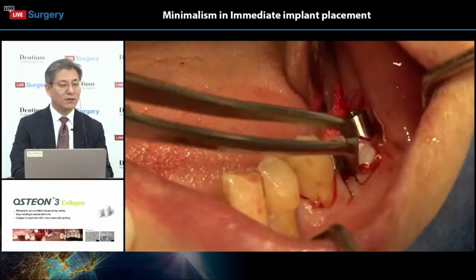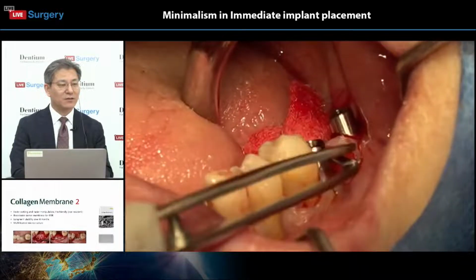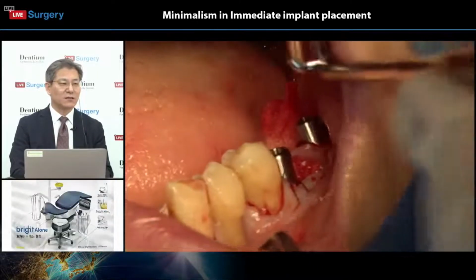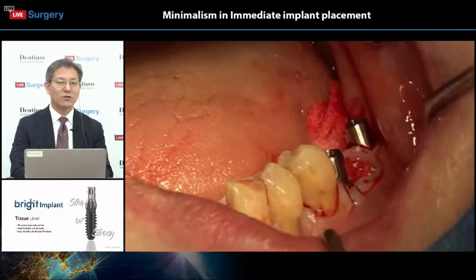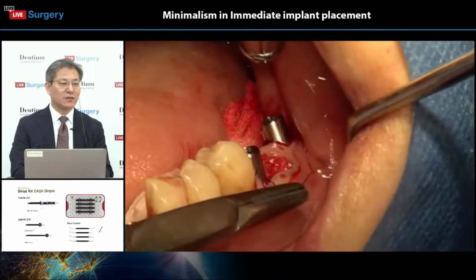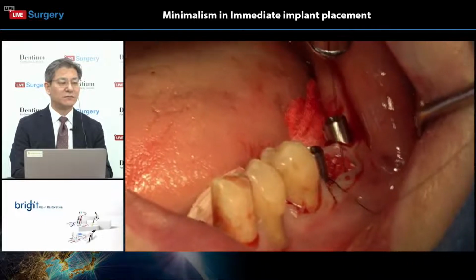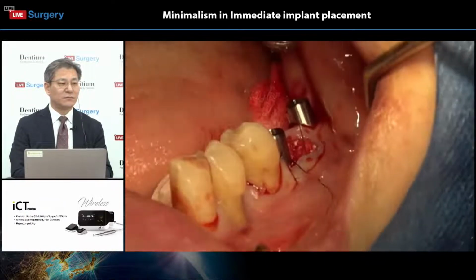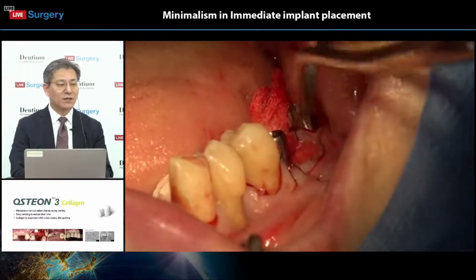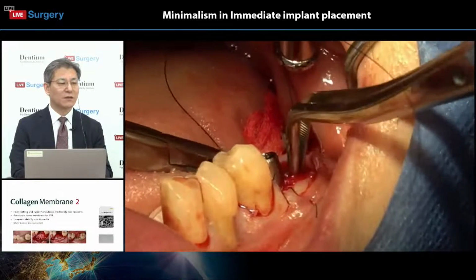Okay. Oh, yeah. He also applied the collagen graft too. Yeah, this the collagen graft, the multi-layer product of the collagen. So friendly to soft tissue. So promote to faster healing of soft tissues. This collagen graft was applied on this socket, exposed socket area for covering.